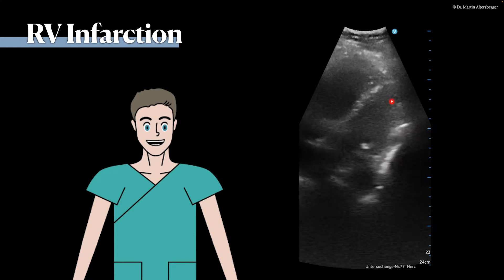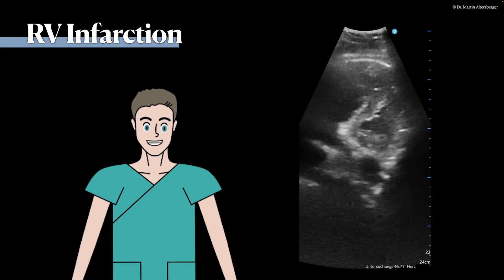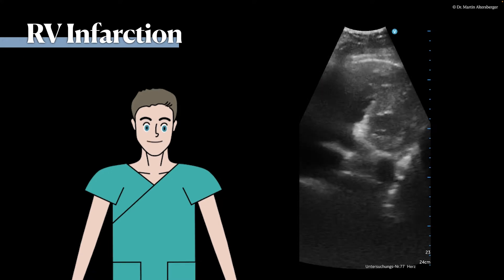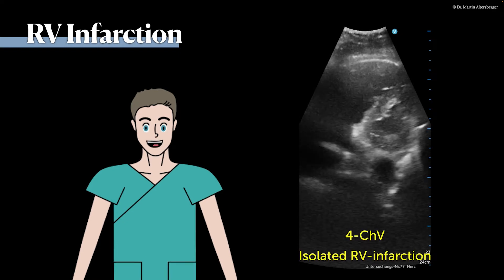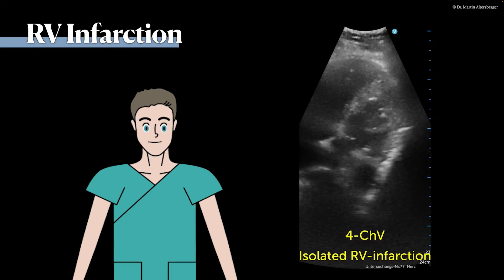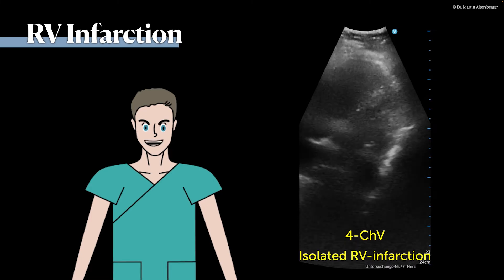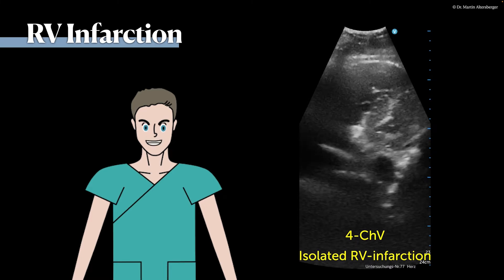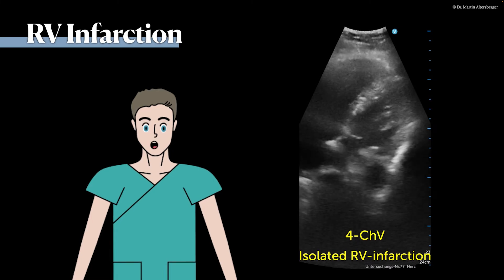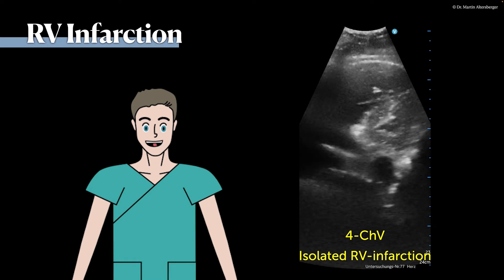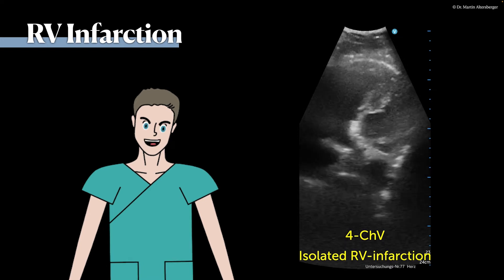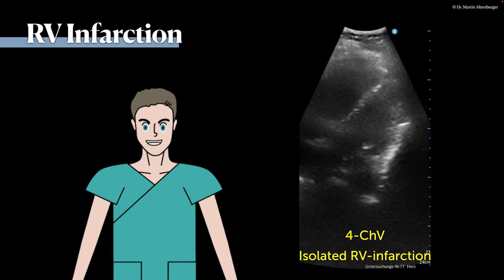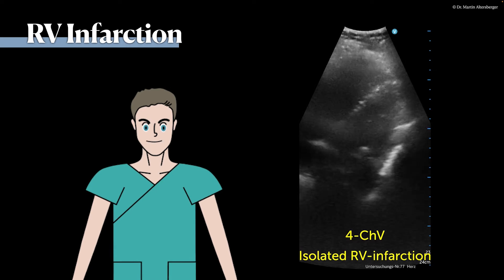The right ventricle is dilated. The left ventricle doesn't seem to have a problem, but truly the right ventricle is the chamber we have to think about. Due to the lack of contraction of the right ventricle, we had mainly a volume problem, which has to be resolved with volume treatment and of course with angiography.